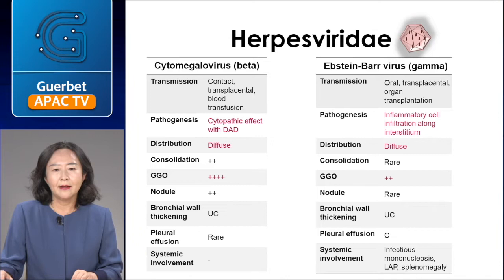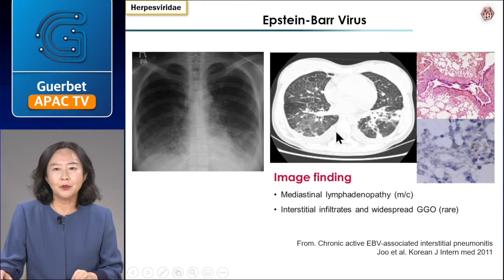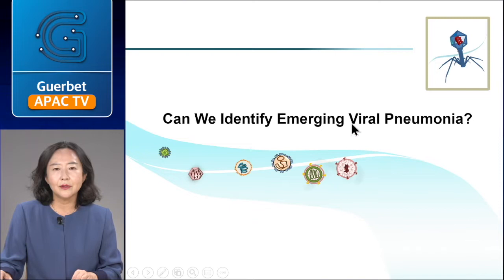Epstein-Barr virus is another Herpesviridae family member. Although rarely experienced, it can be a pathogen of pneumonia with an interstitial pattern. This is a case from an article. EBV pneumonia shows diffuse interstitial infiltrates and ground-glass opacity. So, viruses in the same viral family share a similar pathogenesis of pneumonia, and the imaging patterns have distinguishable characteristics — though not all cases manifest with typical patterns.